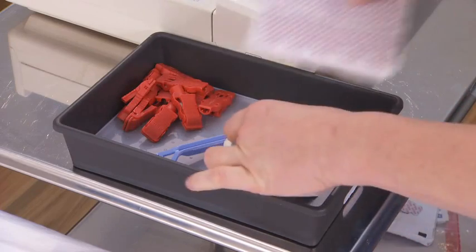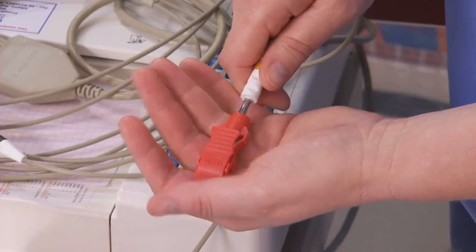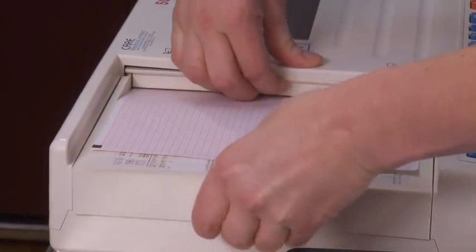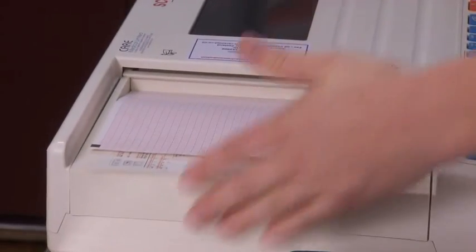Follow standard precautions and wash your hands. Set up the tray with the necessary equipment. Connect the alligator clips to the leads. Check that the ECG machine has adequate paper to record the ECG. Check the physician's order.